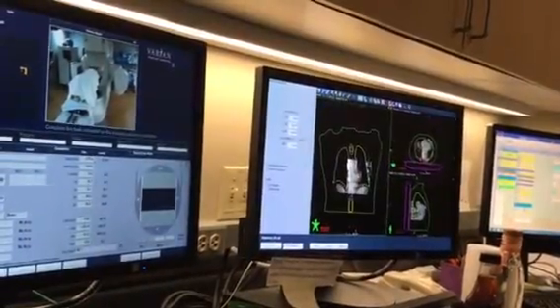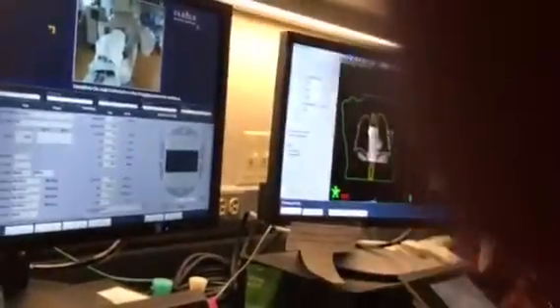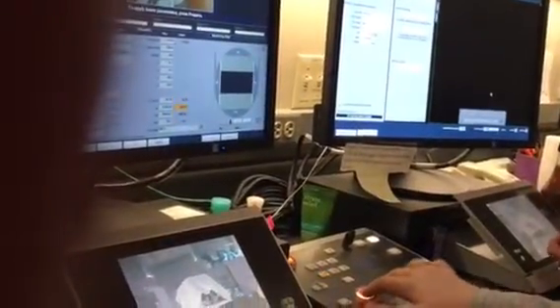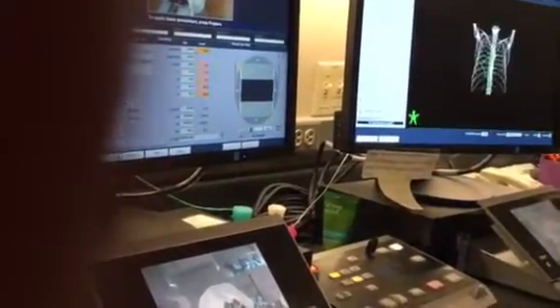So did you have a question about the imaging? Yeah, about the treatment itself, I guess. It's going all around him. So are the organs, like his lungs, those yellow, those are his lungs? Those are his lungs. So it goes through his lungs? I'm trying to understand. Right, it'll be easier to show you anatomically. You're asking really good questions. It's easier to explain while it's being treated.